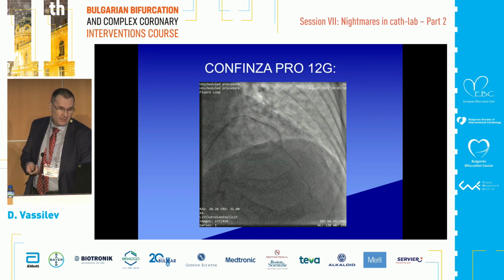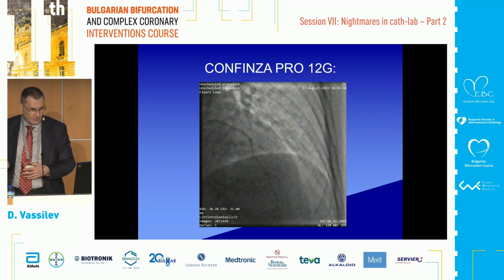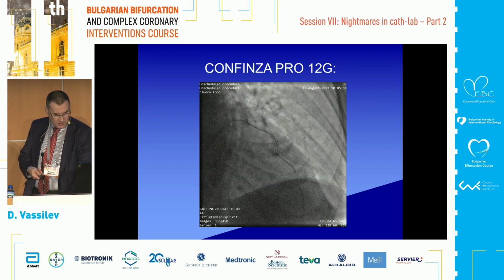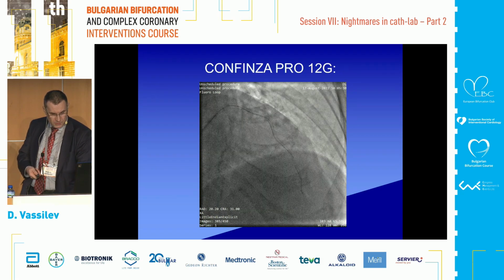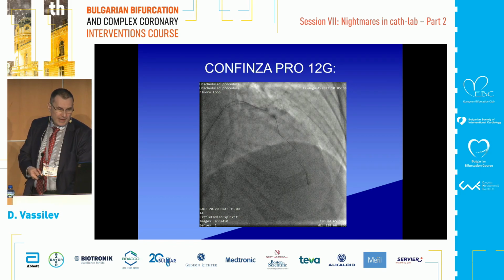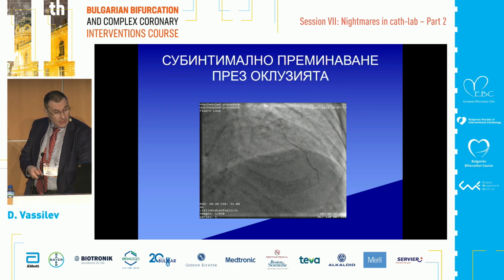Then subintimally we passed, as you see, the patient moved. She was quite unstable during this procedure. However, it was possible to pass behind the wires into the true lumen subintimally.